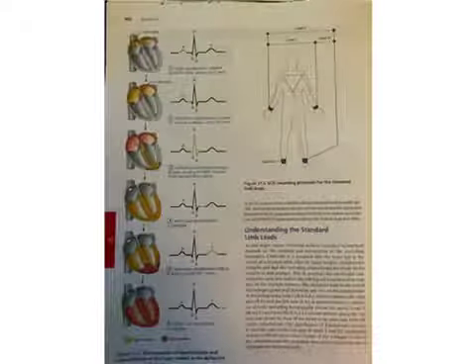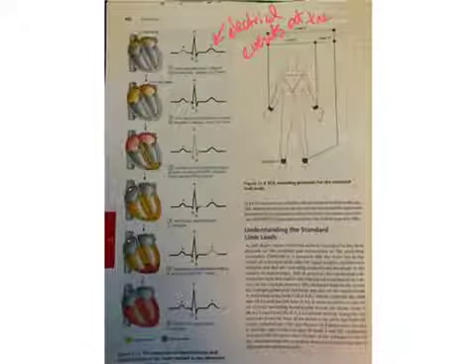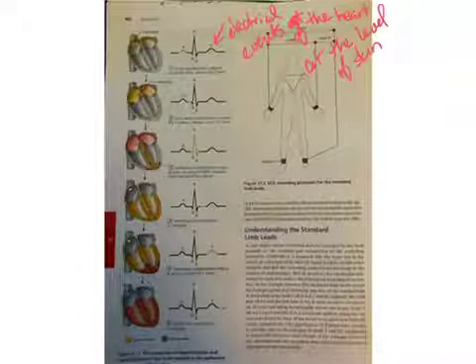As we turn the page in your lab manual to 452, what you have to understand is that EKG only shows electrical events of the heart at the level of skin. This does not show contraction or relaxation whatsoever.